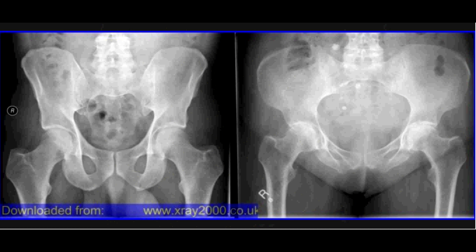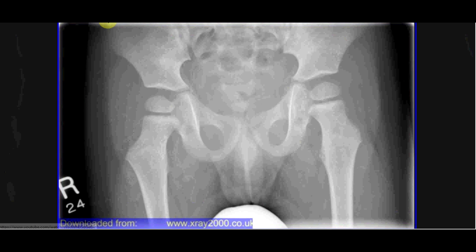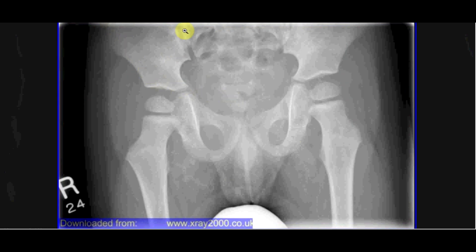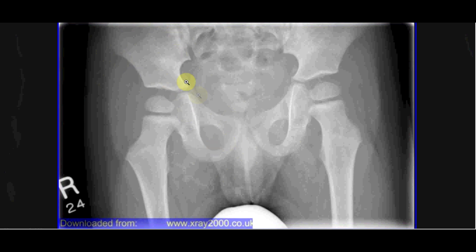Another thing to consider with the pelvis is that it is made up of three bones. In an AP pelvis of a 14-month-old baby, the bones of the pelvis are not yet fused like they are in an adult. In the child, we have a separated ilium, ischium, and pubis — the three bones of the innominate bone, which forms the hemipelvis. We can also see that the femoral head is unfused in young children.